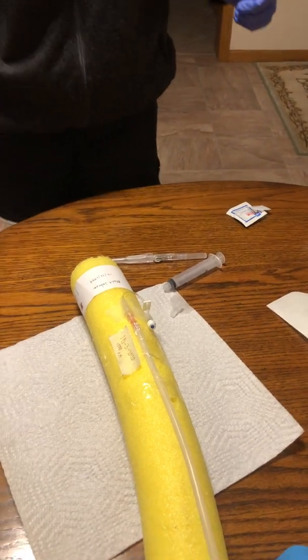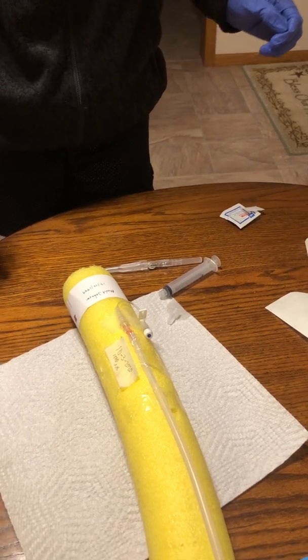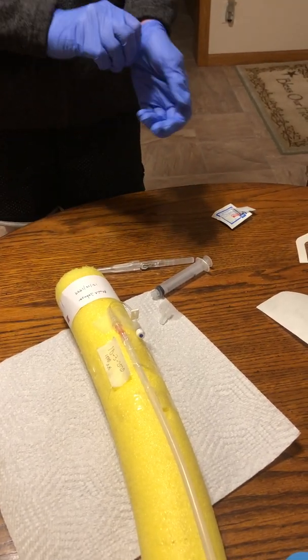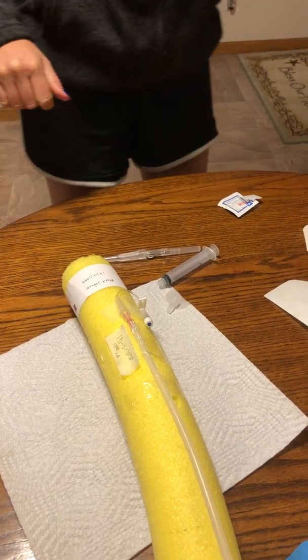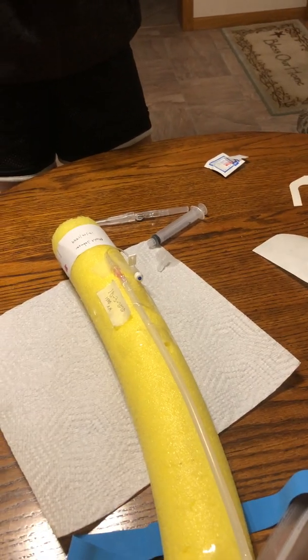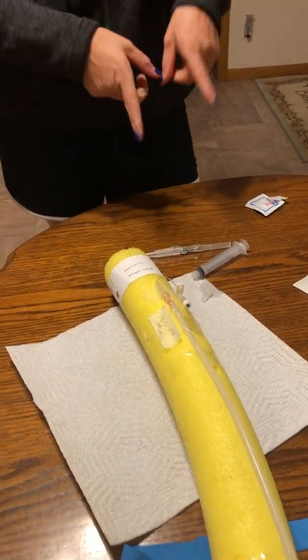Good. Now, I need to take off my gloves, and then I would wash my hands. And then I would make sure to dispose of my supplies. So I dispose of my supplies in the garbage, and I would dispose of my sharps in the sharps container. And then I would document my findings. So I would document the site of administration. I would document the start time. I would document the end time, document the date.